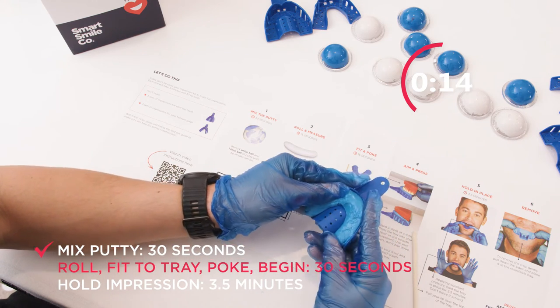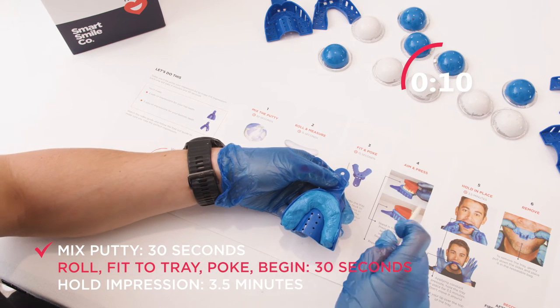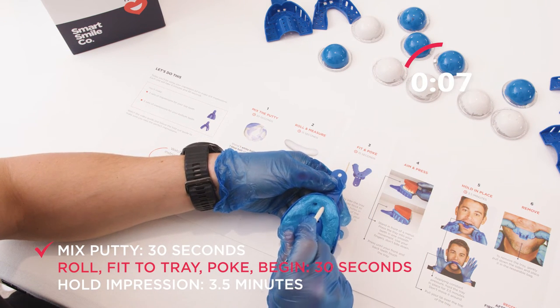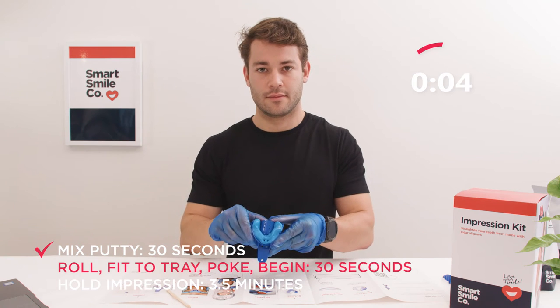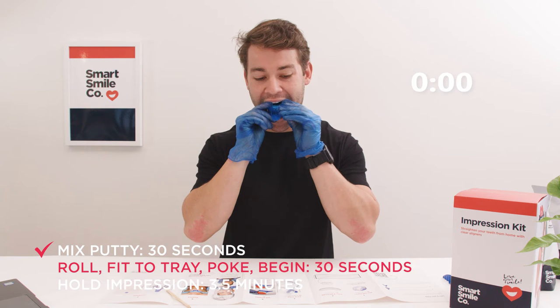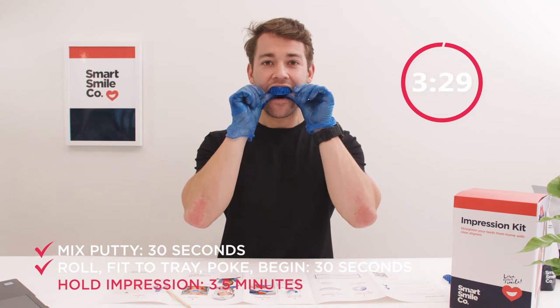Now fit it into the tray and poke two guide holes in the front centre. Looking in the mirror, use the holes as a guide to centre the teeth. Use your fingers or thumbs to press the tray into your teeth in one smooth movement until your front and back teeth touch the tray.